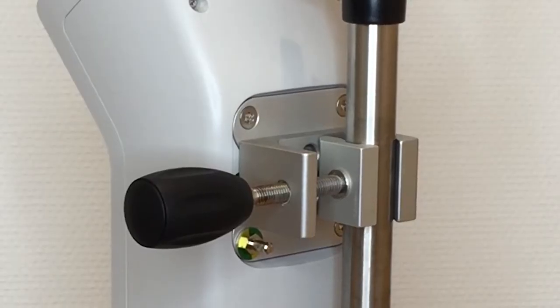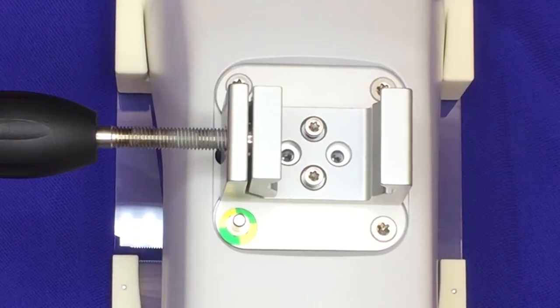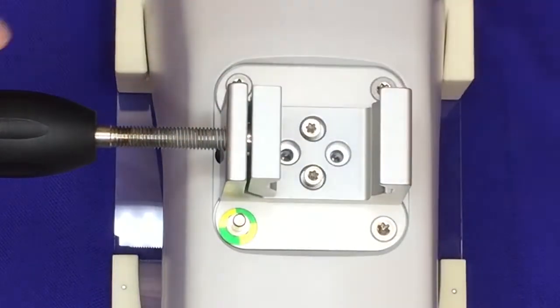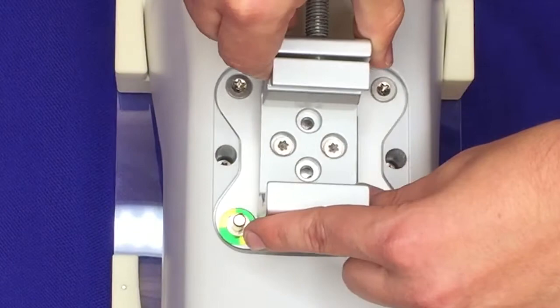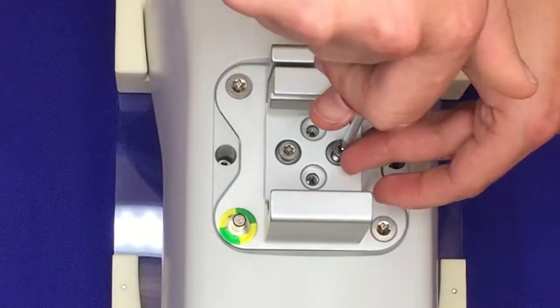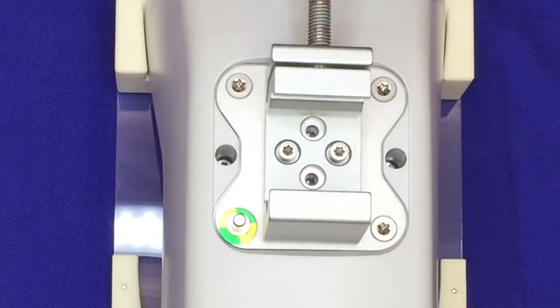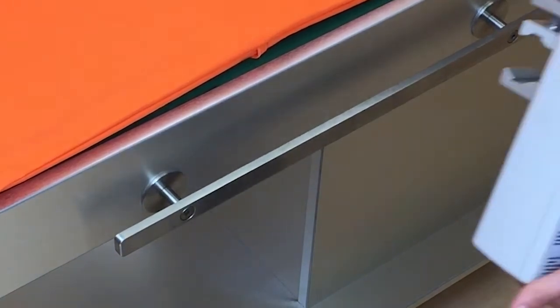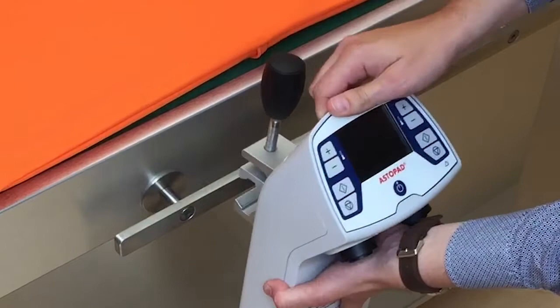For safe installation, the Astopad control unit is equipped with a universal mounting clamp at the backside of the device for attaching to an infusion stand. By opening the screws, it is possible to rotate the clamp. The device can also be attached to a standard medical rail without additional accessories.